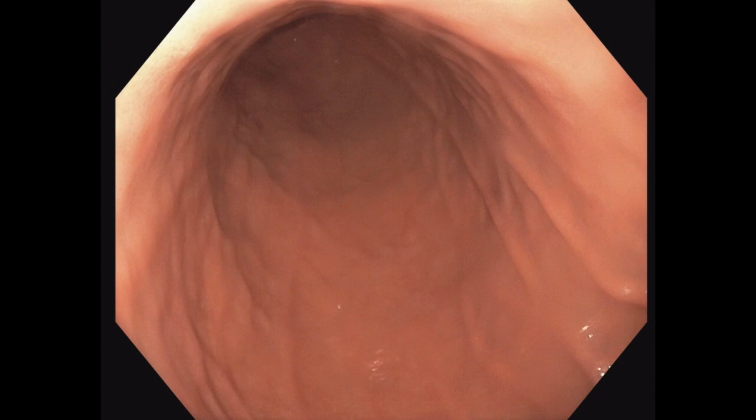Looking down, I orient the view as shown. 12 o'clock is lesser curvature, 6 o'clock is greater curvature, then anterior wall is 9 o'clock, and posterior wall is 3 o'clock. The picture I took right after entering the stomach was a bad example of pictures without orientation.